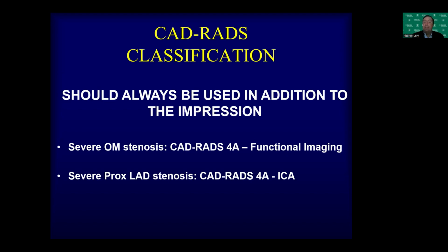That is correct. Both will be CAD-RADS 4A because there is a single vessel with severe stenosis if the vessel is greater than 1.5 millimeters. That is why you have the impression of the report, and that's why the CAD-RADS should always be used in addition to the impression.